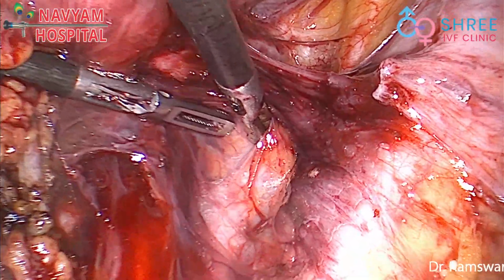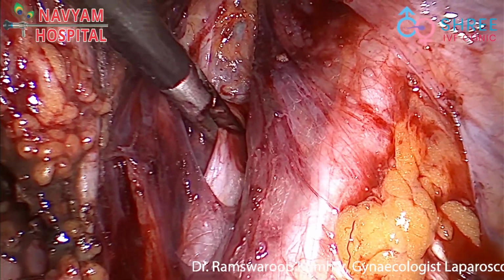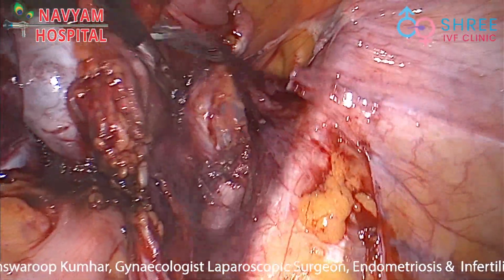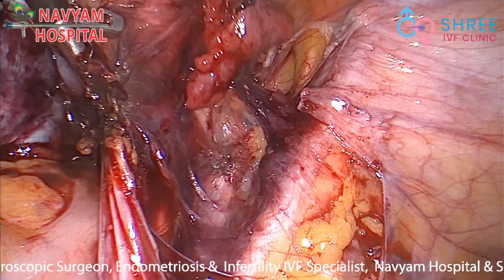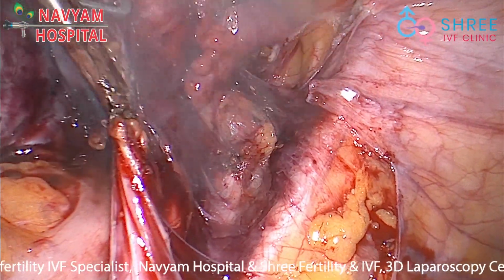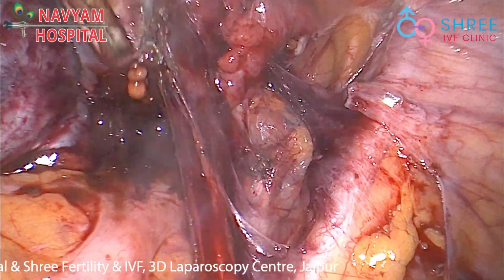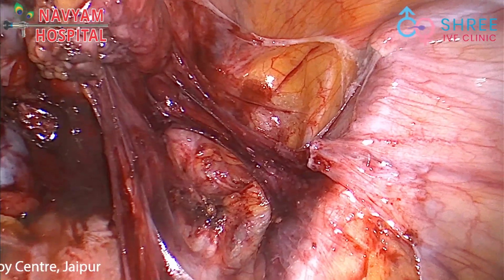For this coagulation, we use coagulation current with the bipolar shearer, and then the same window was made for the IP ligament, and after proper coagulation, the IP ligament was cut down. Now the blood supply to both adnexa and uterus is completely cut off.